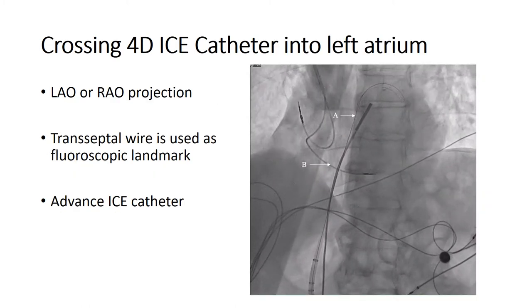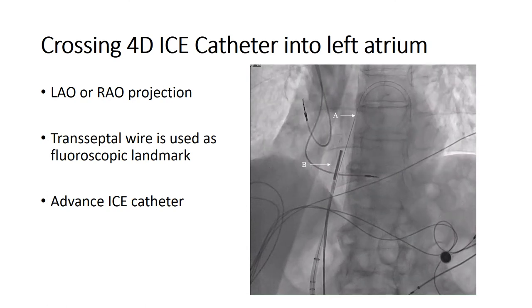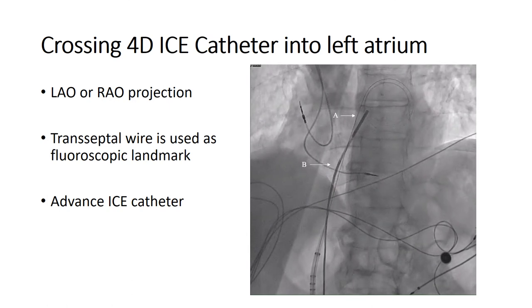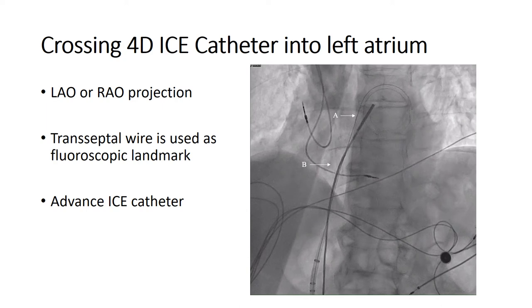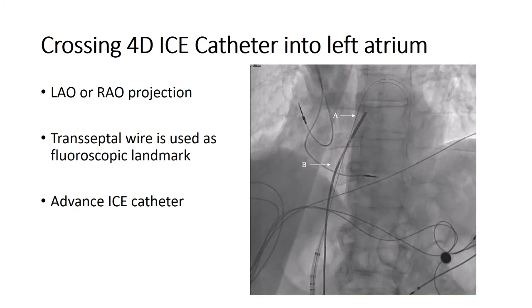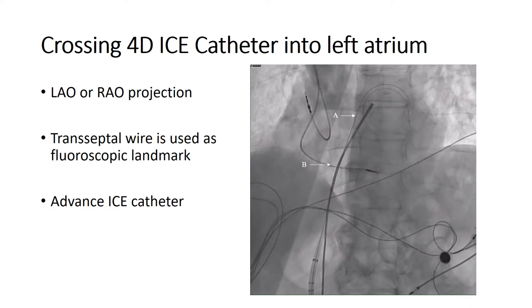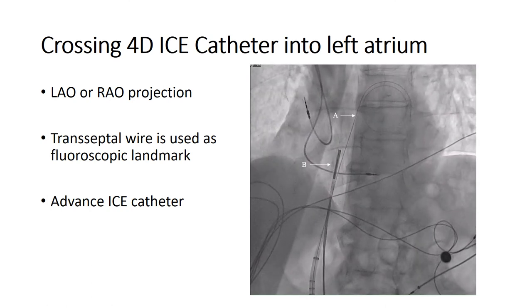Before crossing the ICE catheter into the left atrium, make sure to dilate the interatrial septum using a back-and-forth movement with the Watchman delivery sheath, then retract the Watchman sheath back into the inferior vena cava. Project your image from a LAO or RAO projection and advance the ICE catheter, tracking and using the transseptal wire as a fluoroscopic landmark. If you encounter any resistance while advancing, stop, retract, and re-advance while adjusting the catheter direction, using different angiographic projections to stay in line with the transseptal wire.